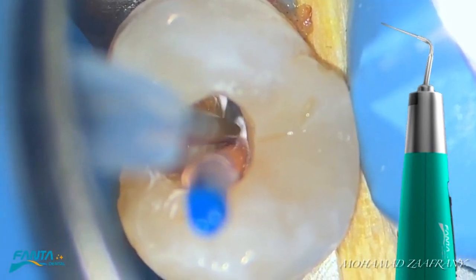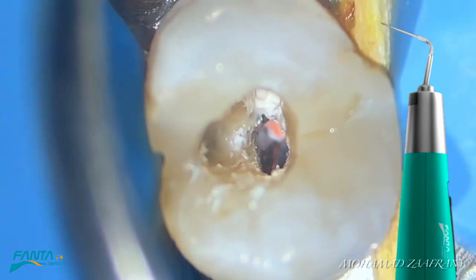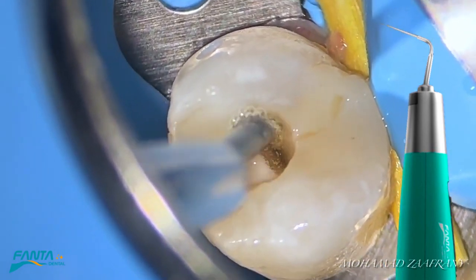The device could be used for down-packing the master cone in different obturation techniques, and it can also be used for intra-canal heating of the irrigant to improve disinfection.